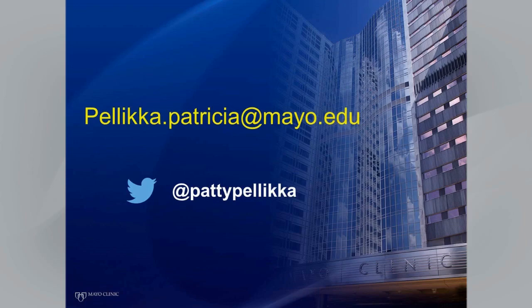There's a question about assessment of diastolic function and whether we can use E to E prime when there's fusion of the E and A waves. That's a good question. I think that it is best to wait until the E and A waves are a bit unfused. There's a point at the test when they're completely fused and you really can't tell what's going on. Our approach is to assess wall motion and ventricular function first, tricuspid regurgitation velocity second, and then to go for the E to E prime if we're doing a treadmill test.